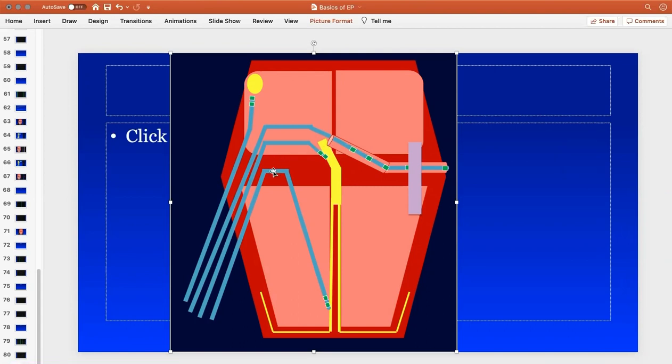But when we stop pacing, the impulses went down and there is no new pacing coming through, and then the A conducts and it went down to the V through the slow pathway, and then it went back up and it stopped. Does it make sense? Yes. So the last pacing will cause two beats. The last pacing went up through the pathway, down through the slow pathway, and then went back up through the accessory pathway, and then it stopped. So you had a re-entry, you had one run of AVRT. That's what happened with AVRT. Down and up, that's your AVRT.